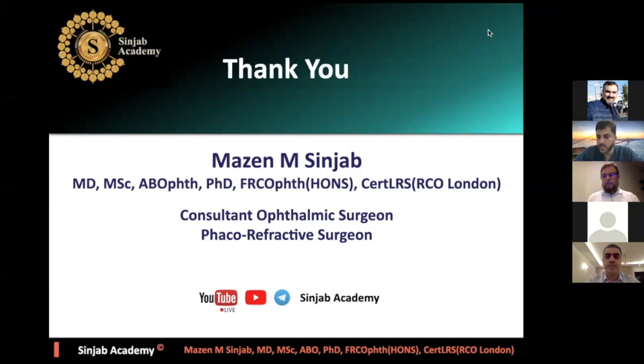Thanks a lot, Dr. Mazen, for your enormous presentation as normal. I have two questions. First, some schools have the ideology that there's nothing called keratoconus suspect nowadays.